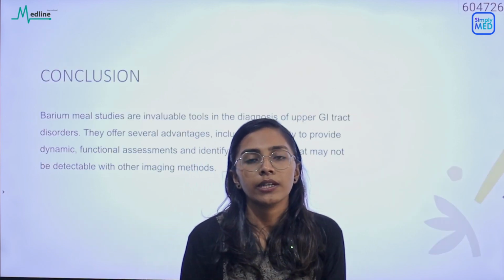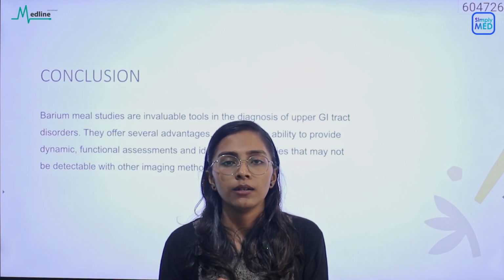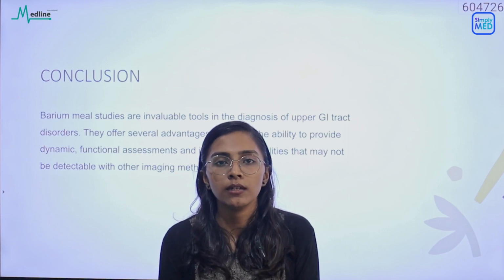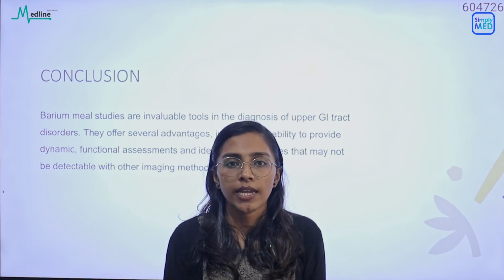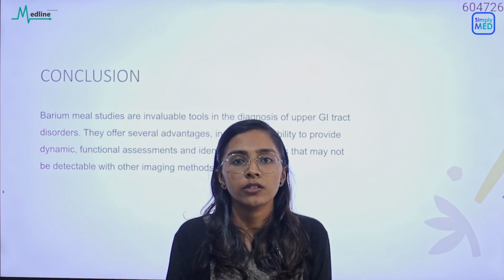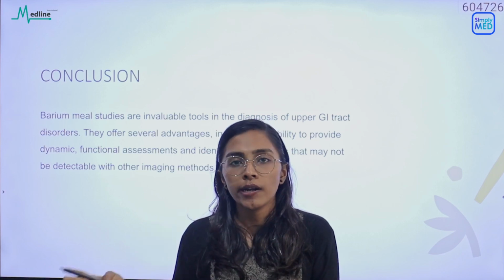I guess with this we can conclude today's topic. Before we conclude, let's have a quick recap of what we discussed. What is barium meal study? It is the examination of our upper GI tract, including the distal part of the esophagus, the whole stomach, and the proximal part of the duodenum, with the help of a contrast medium.